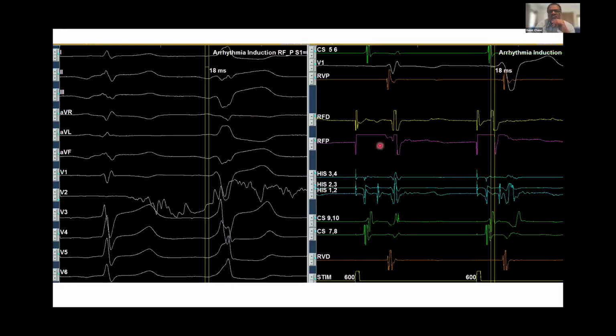But if it is just because of rapid conduction where the AV node has not yet blocked, but the pathway is already blocked, we would not be able to say that at that point. But this is what we look at. What are the atrial EGM and the ventricular EGM in normal rhythm doing? What is happening when there is a premature beat? So we might have. Keith, we'll need to wrap up now because we're running short of time.